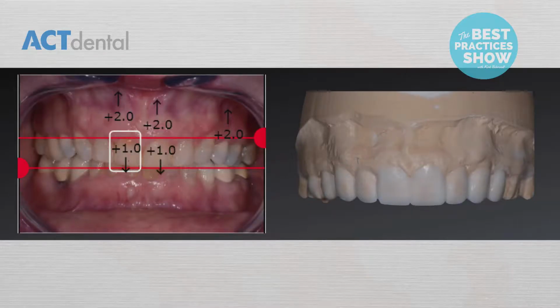So the next slide, the fourth slide, is putting the 2D and the 3D together. And I think this is probably one of the most important slides. So the 2D, if you remember from earlier sessions, we talk about what's off with function, how do we fix it? We start talking about aesthetics and a global, macro, and then micro at the end.